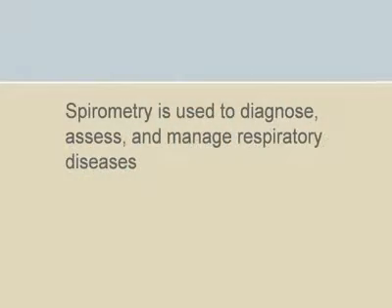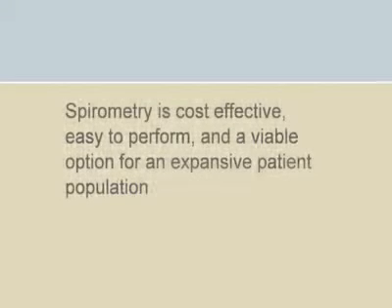Spirometry is used in the diagnosis, assessment, and management of asthma, COPD, cystic fibrosis, and other respiratory and systemic diseases. It has proven to be cost-effective, and the relative ease with which it can be performed makes it a viable tool for an expansive patient population.